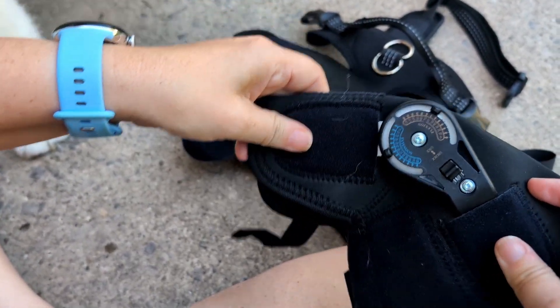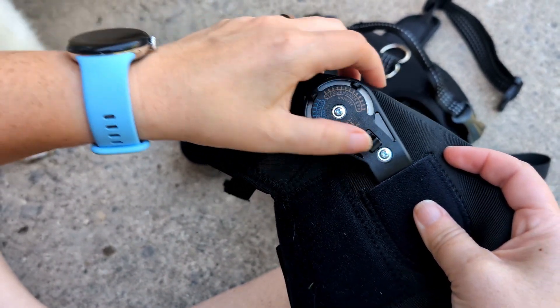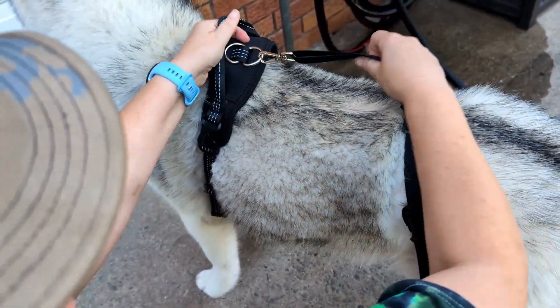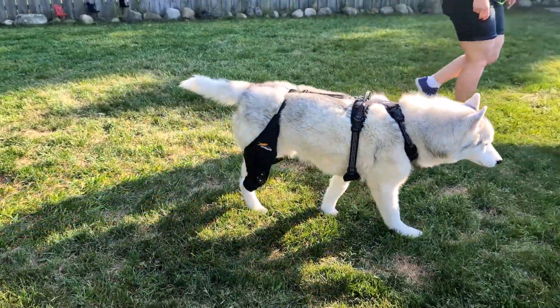So depending on how much support is needed on what side, you can adjust it fully. This is made of a neoprene fabric, which is breathable and really lightweight. So if your dog is going to be wearing this for an extended period of time, they're not going to be overheating in this. Make sure that you measure your dog for a proper fit.